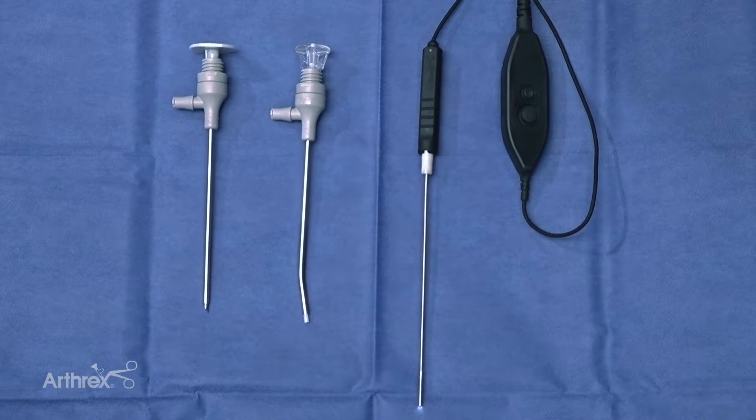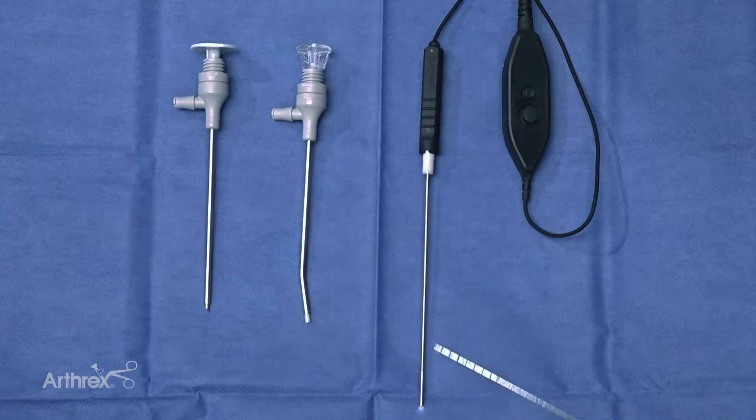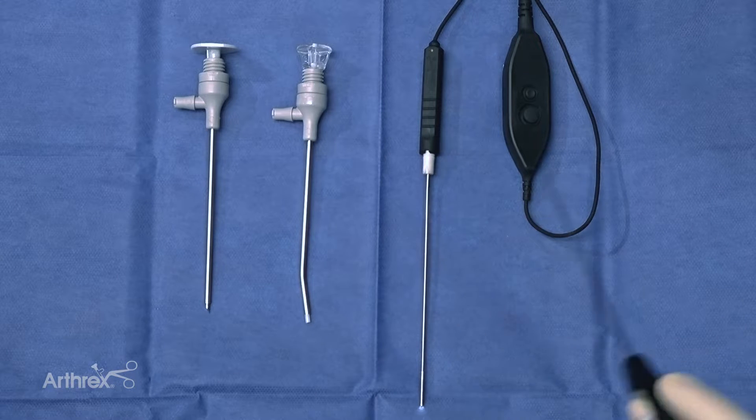Hi, my name is Matt Brandt. I'm out of Reconstructive Orthopedics in Sewell, New Jersey, and today we're going to be doing a diagnostic arthroscopy of the ankle. We're going to be using the Nano Needle today, which is a new design. It's still a 1.9 millimeter scope, but with a little difference in design.